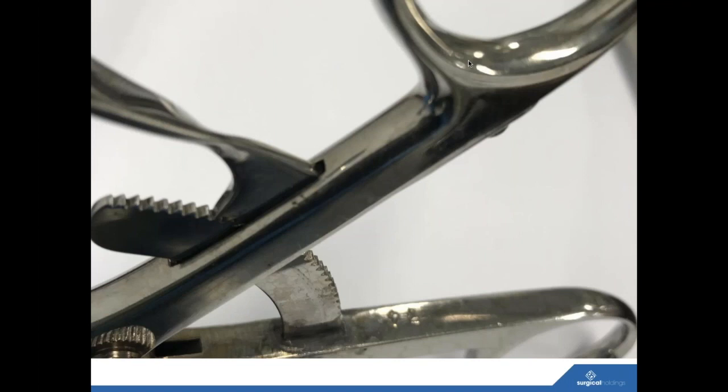This is something we see a bit less nowadays because of the widespread use of laser welding, but these sorts of retractors, your Travers, West, Wheatlanders, previously may have had either no sealant round the rack here we see at the bottom, or potentially solder or something like that, but that could easily be eaten away. And again, it's a perfect recess for when the instruments are washed, for them to sit in there, remain wet and for that damage to occur.